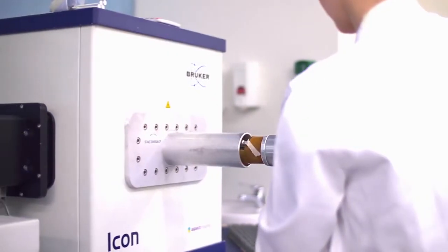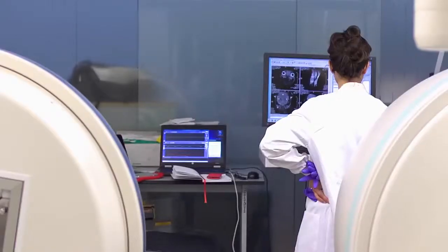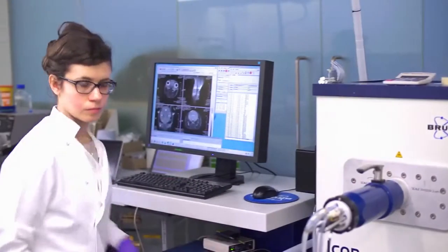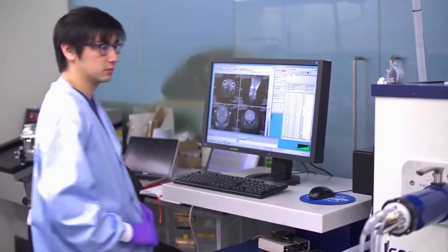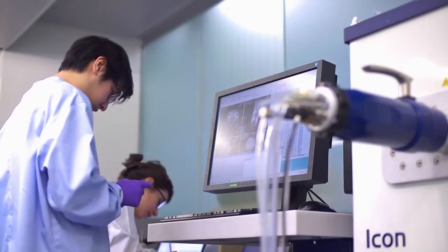Space is always limited in labs, so we've got an MRI scanner here in the nuclear medicine facility, right next to the PET and the SPECT scanner within this tiny space, and that again allows great access. You can readily and quickly move between your nuclear medicine systems where you've got all your cellular and metabolic information straight into the MRI scanner to get that lovely anatomy.